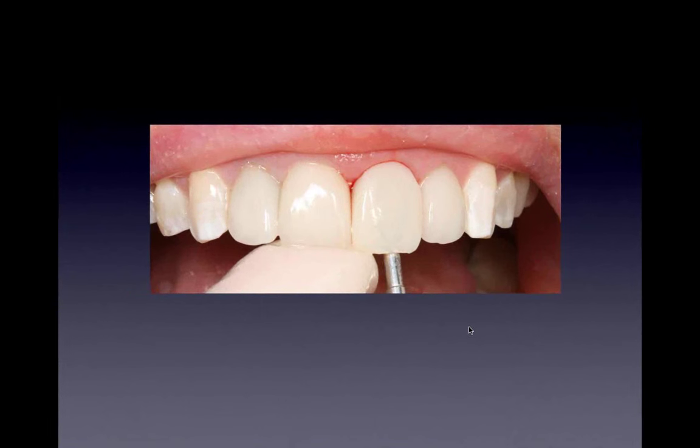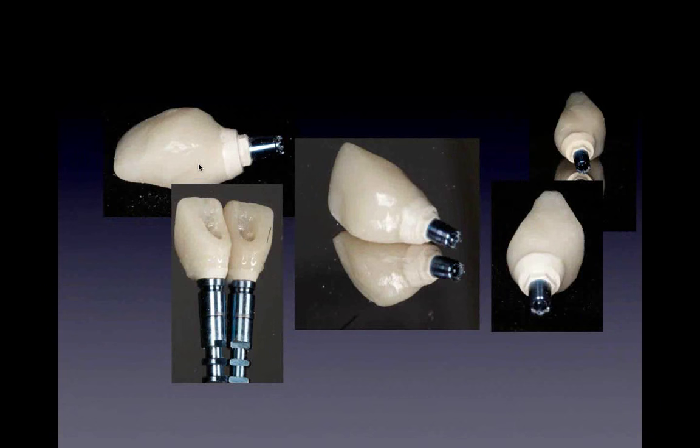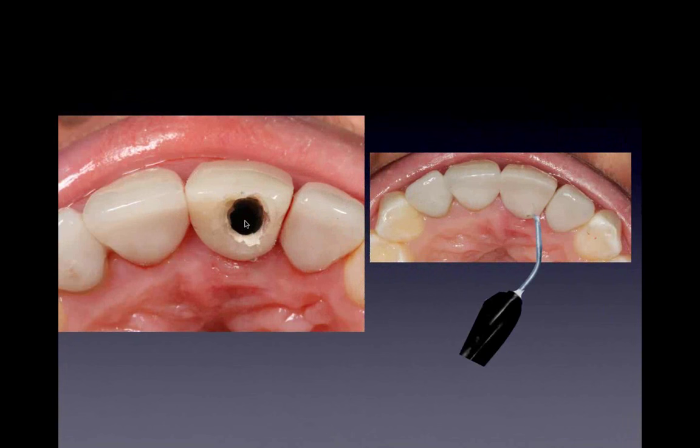So this is a technique that basically using provisionals and the composite materials, we can get a really nice look on it. Around the contour of the actual implant abutment, we're using our flowables. We're flowing up everything here, contouring it, polishing it, making sure it's fitting really nicely. And when we screw it into position, guess what? The exact shape that was the original tooth that she got extracted is now copied.